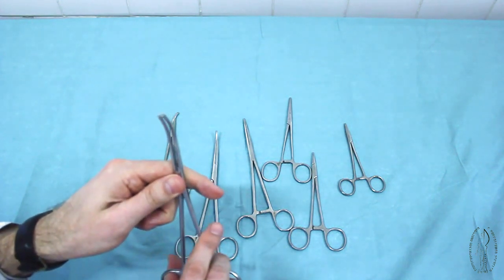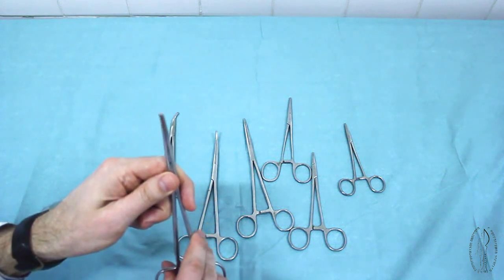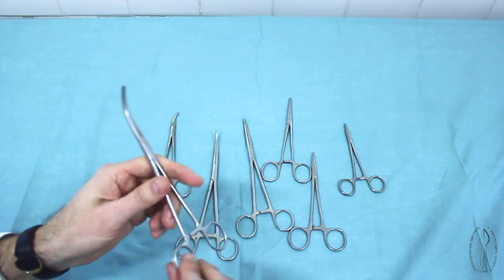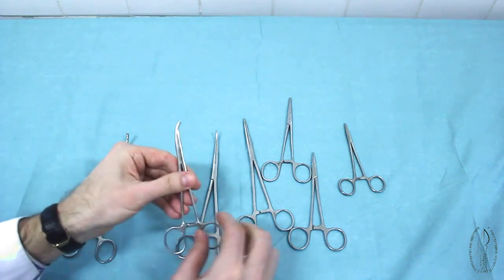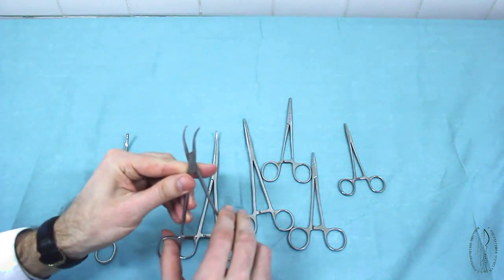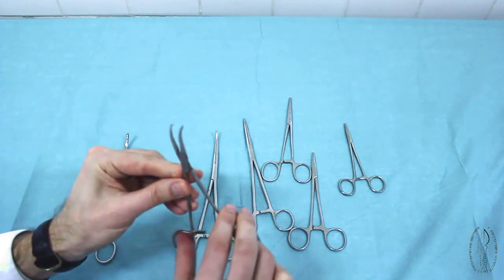Hemostatic instruments with teeth, regardless of their size and shape, are called Kocher forceps. Here is an example of long and curved Kocher forceps, and here is a kind of short and curved Kocher forceps.